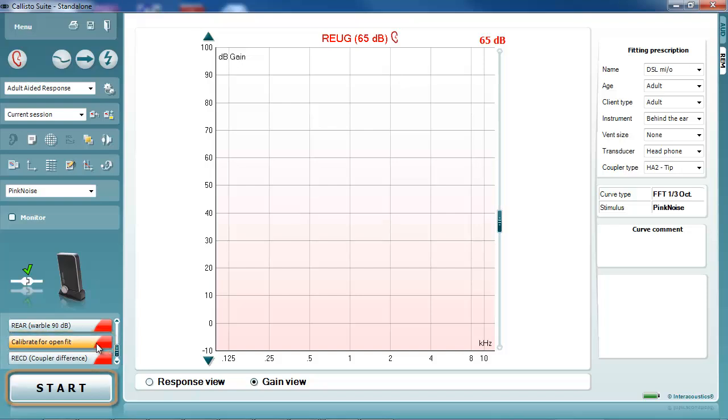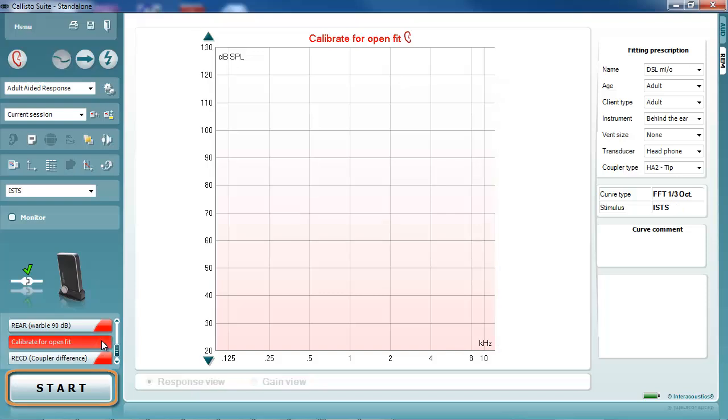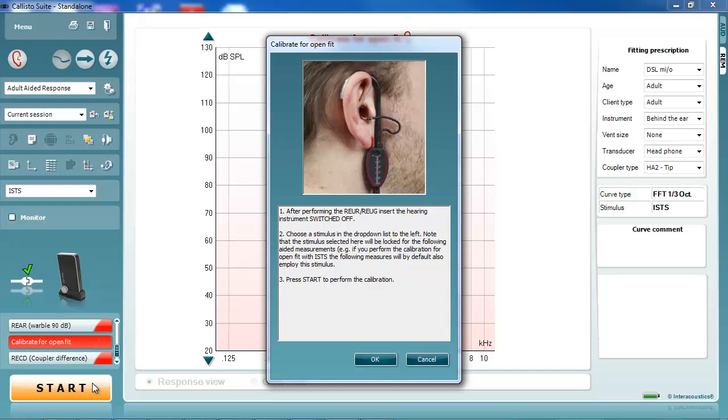When selected, press Start. A window opens which describes the process of switching to and calibrating the stored equalisation method.